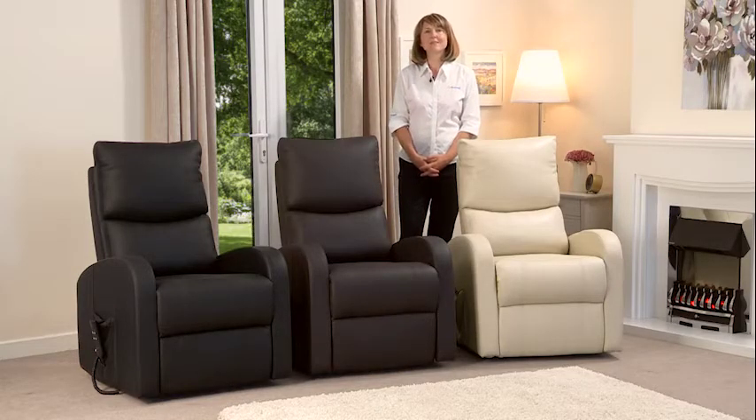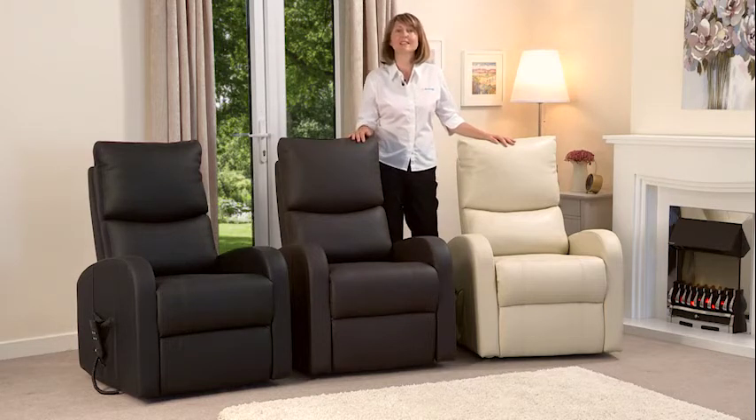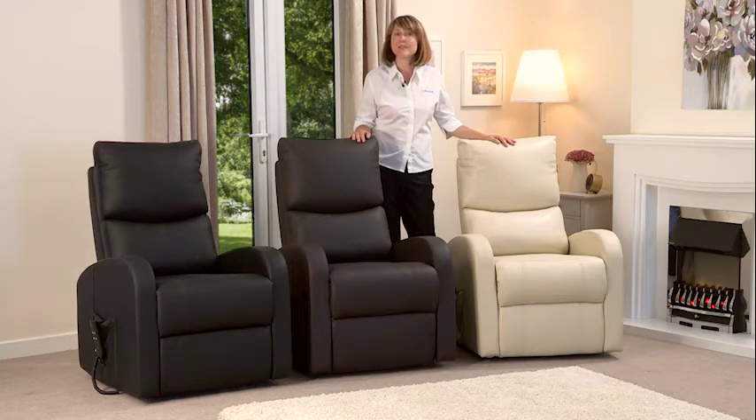Hi and welcome to LiveWell. My name's Laura and I'm here today to introduce you to our Melbourne Rise and Recliner armchairs. The Melbourne is designed for people who find it more difficult to get out of an armchair than they used to. It comes in three colours: black, brown and cream.